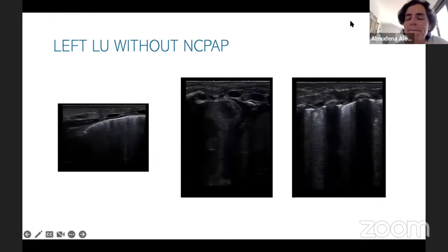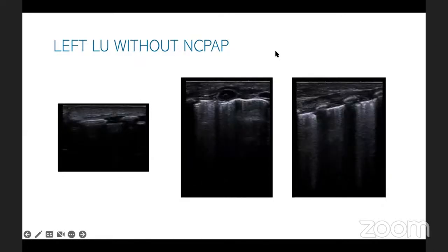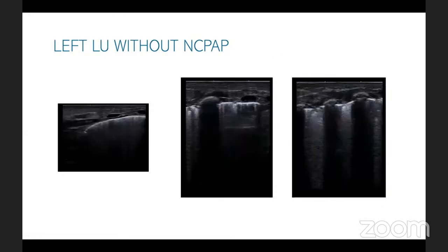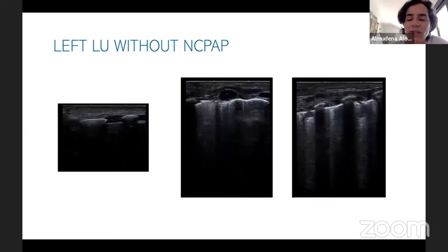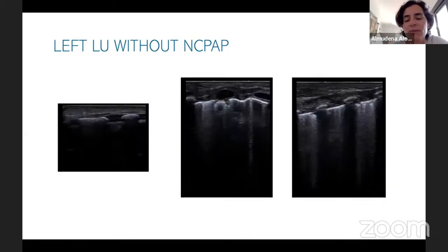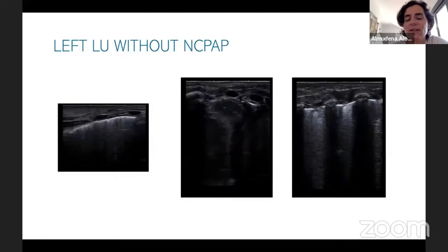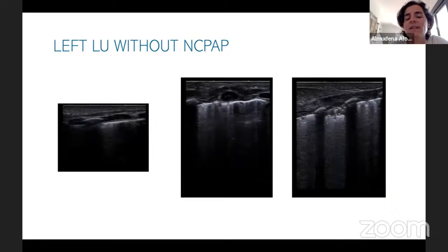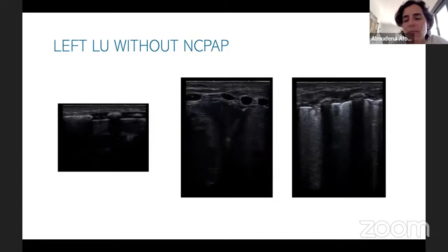To decide whether to put it on or take it off, sometimes people in the NICU do not all think the same. It's a way of seeing what is happening in the lung of the preterm. Of course, with lung ultrasound, there are a lot of people that really don't believe in it. So don't try to use this as the Bible in your unit. You have to begin little by little. There's not much evidence yet, but there will be, because this is something that really works.